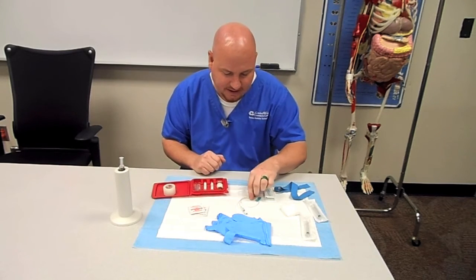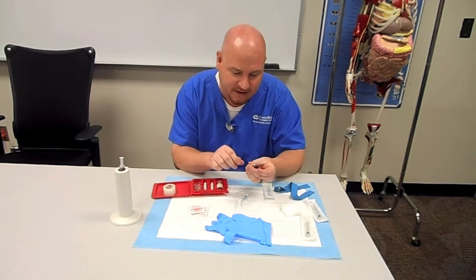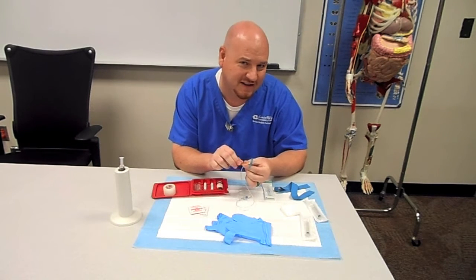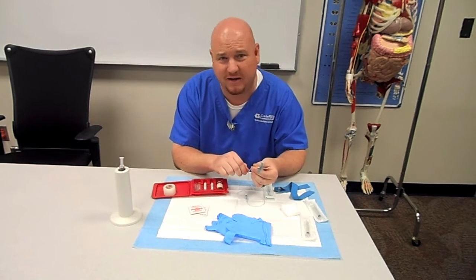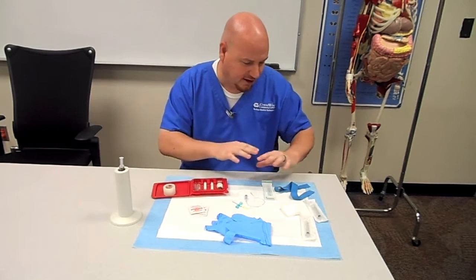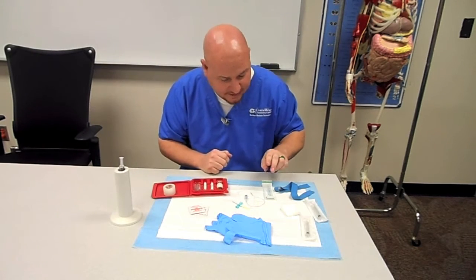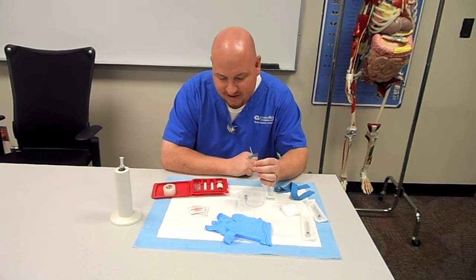Other supplies include a butterfly needle. You want to make sure that your needle is a large bore — 19 to 21 gauge would be about the smallest that you want to use, because you don't want to damage the red blood cells as they're going through. You'll also need gloves, alcohol, and your other supplies. In this video, I'm going to be using the butterfly needle to draw the blood.